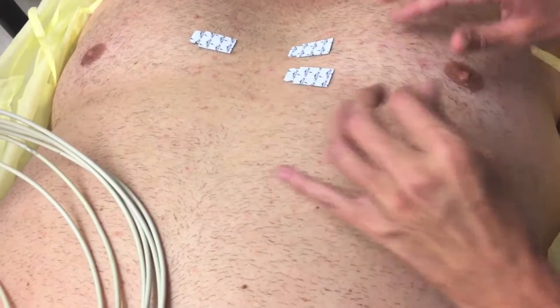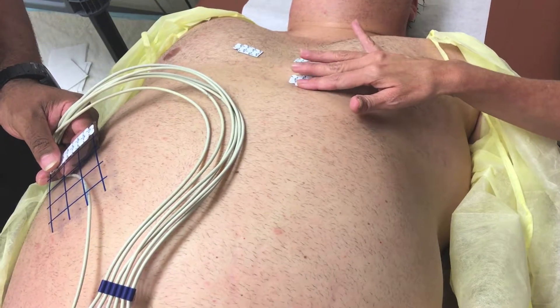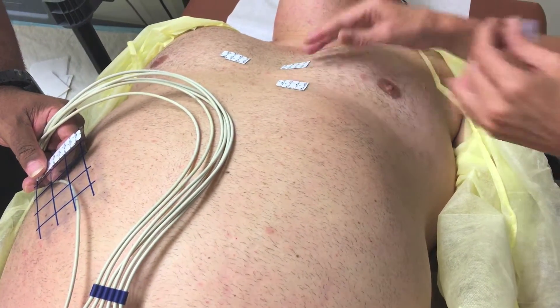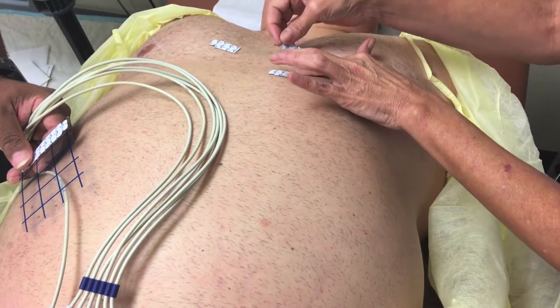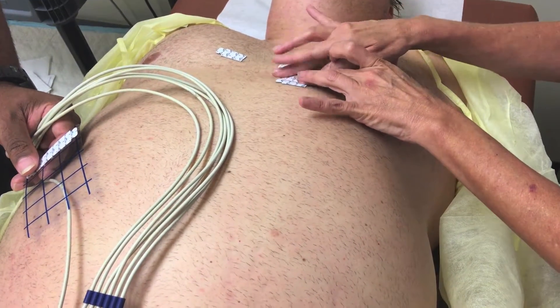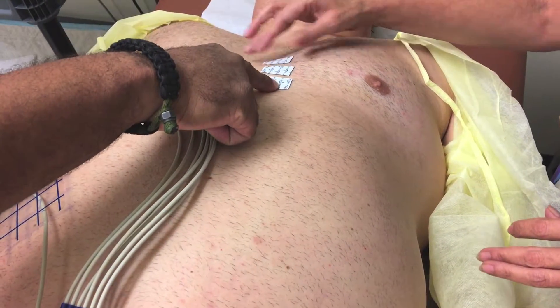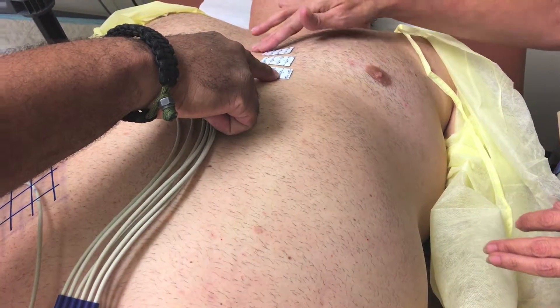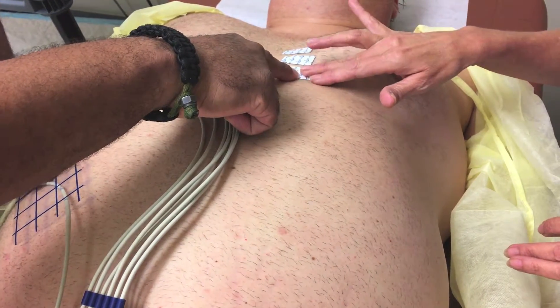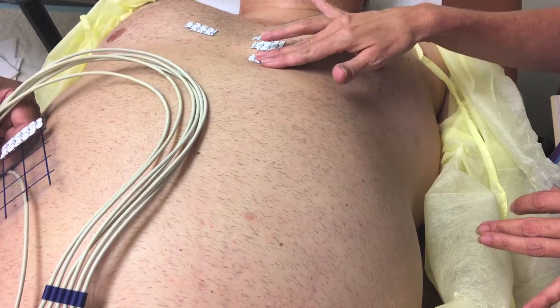V4 is at the mid-clavicular line, and then V3 is going to go midway between the two locations. So V1 and V2 should be at the 4th intercostal space — V1 at the right border of the sternum and V2 at the left border. V4 is at the 5th intercostal, and V3 is midway between V2 and V4.